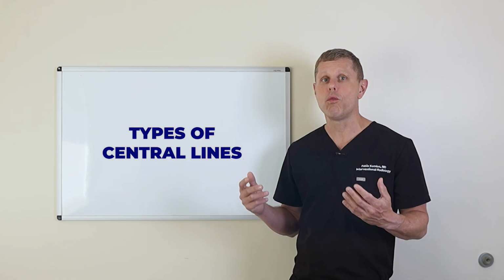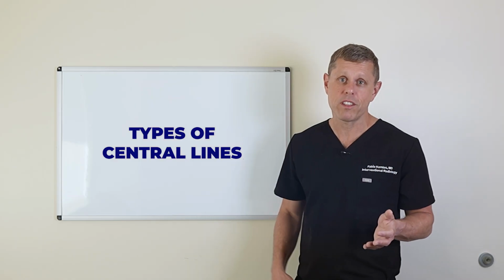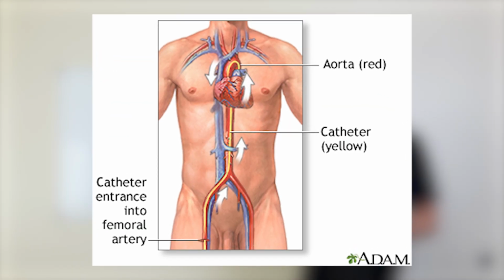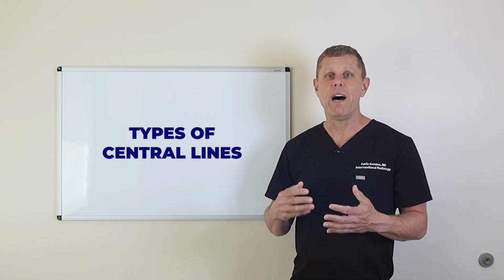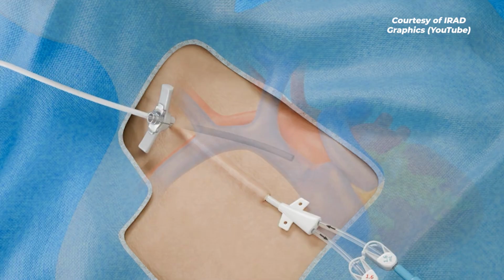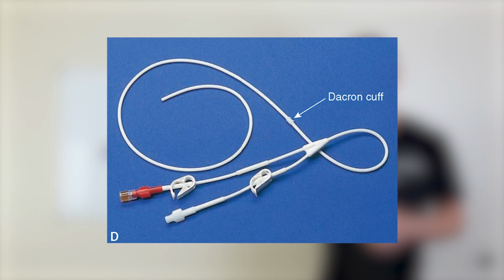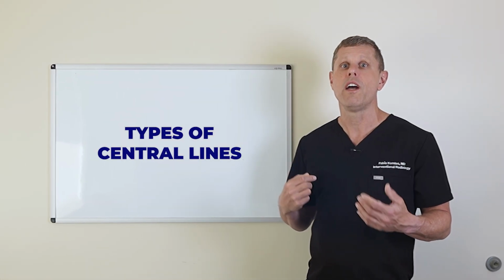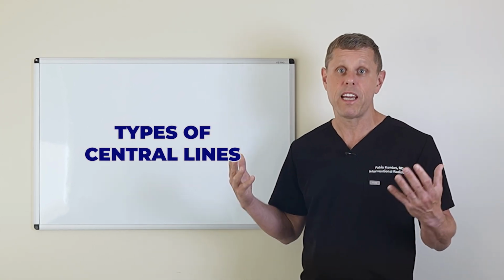Now then we move on to what's called a tunneled central line. So tunneled central lines, they're usually inserted in the chest. They can be inserted in the groin, although we certainly prefer on the chest. And they are essentially, they go into an IV like a regular central line, but they are tunneled under the skin before they enter the vein, so there is more space between the vein and where the line exits the skin. They also have a little cuff that will not only get scarred in the tissue and will prevent infection from going in the body, but also will prevent the catheter from being accidentally pulled.